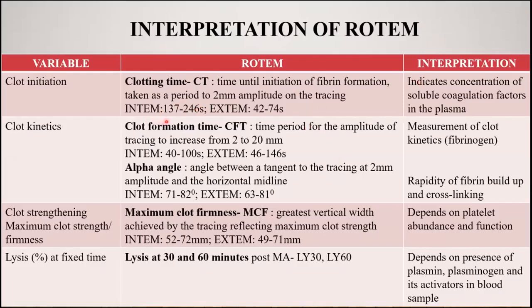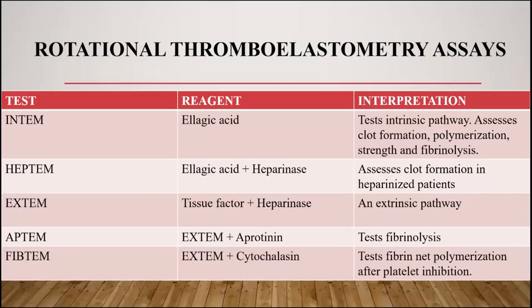Yes, the values of these timings will change, so you need to remember them, and they will also change with respect to the assay you are doing. Okay, the assays we'll be subsequently talking about. As in TEG, similarly in ROTEM also we have various assays which help us to analyze or assess the various components of the coagulation cascade.